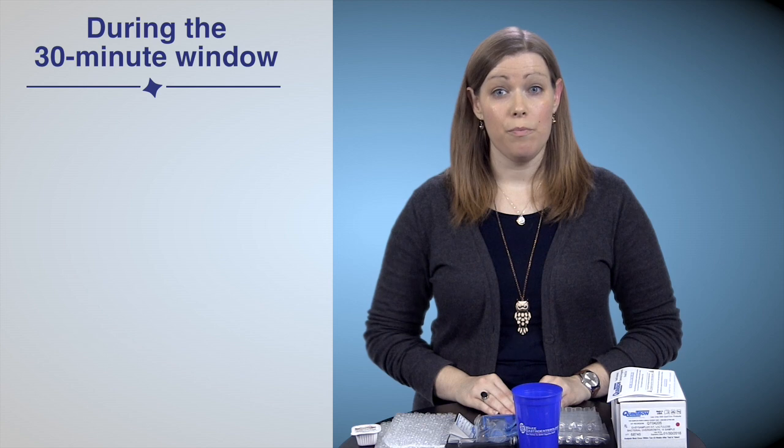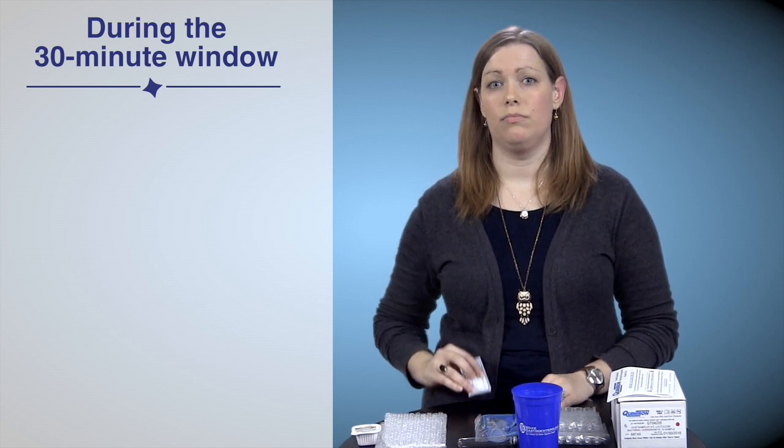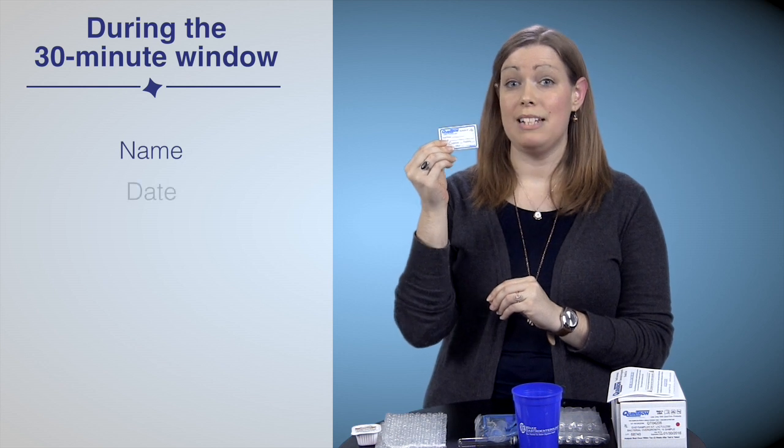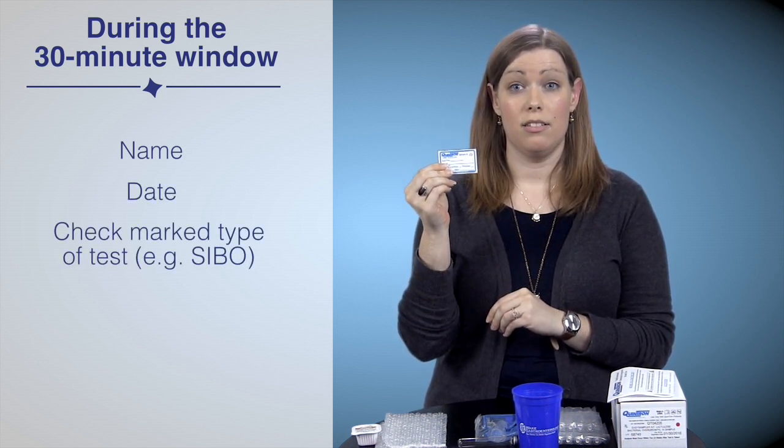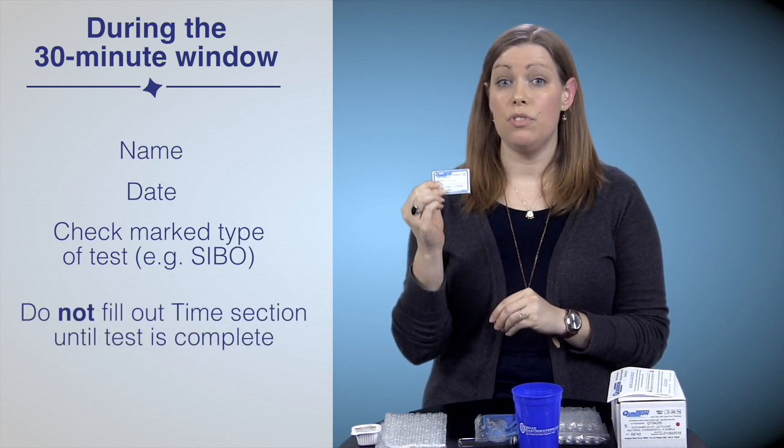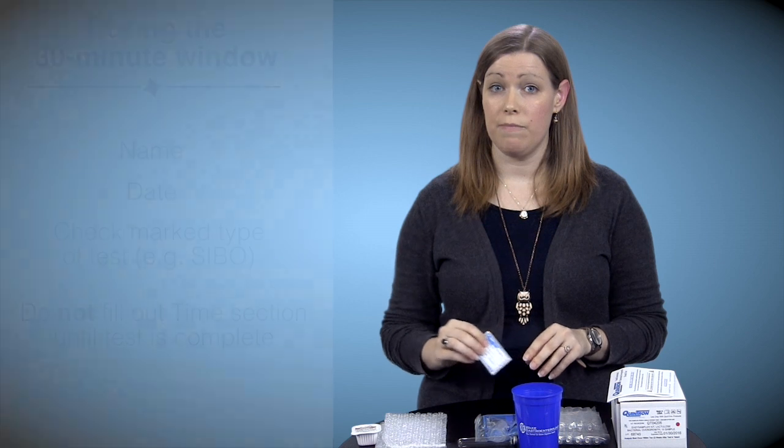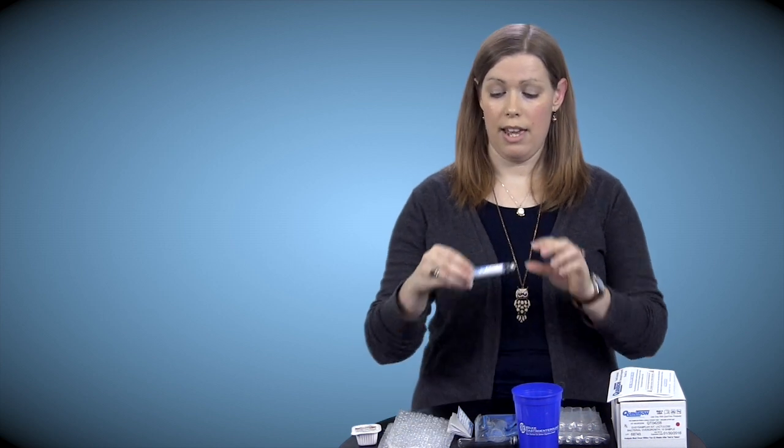During that 30-minute window, pre-fill the labels. This includes name, date, check mark type of test. Example, SIBO. Do not fill out the time section until performed. Each time you breathe in a tube, write down the exact time, peel the label off, and put it on your tube like this. This is a time test, so make sure that you have a clock, a stopwatch, or a cell phone on hand to ensure the test is performed at the correct intervals. Make sure the collection number is correct or your results will be inconclusive. Basically, you don't want to test again, right?